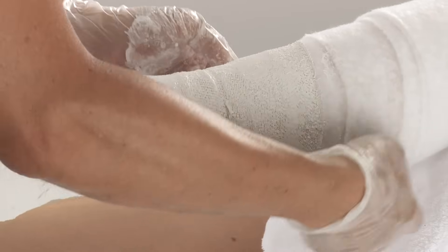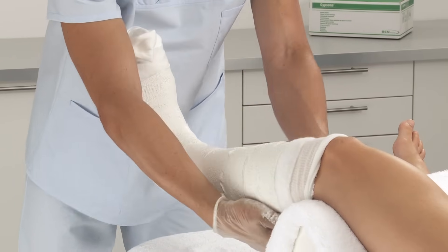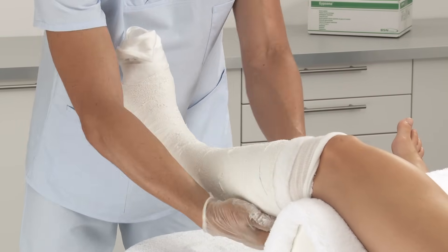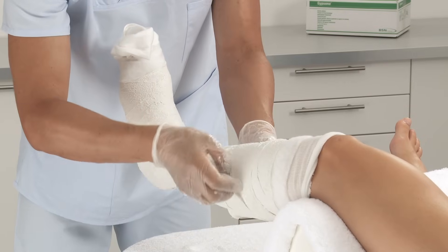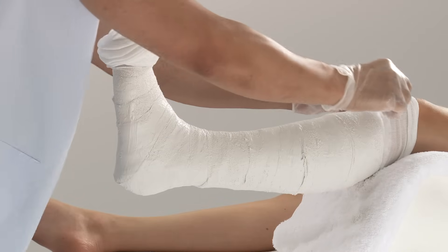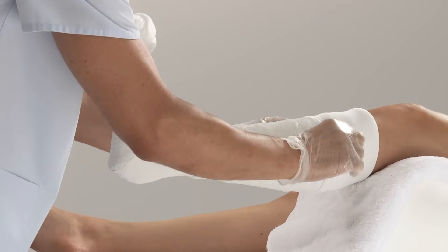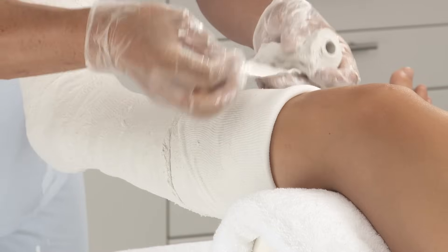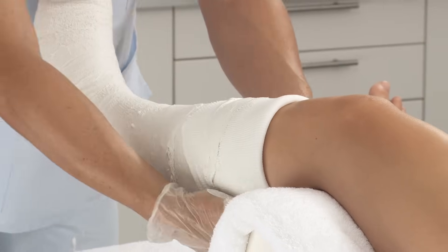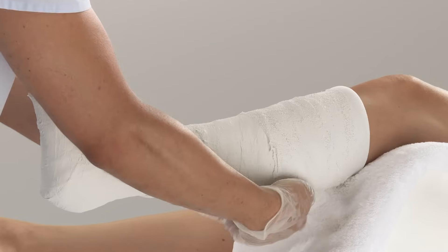Use a second bandage as needed. Fold down the stockinette at the proximal end. Smooth edges provide skin protection and comfort. Use a further bandage to secure the stockinette and another to complete the cast.